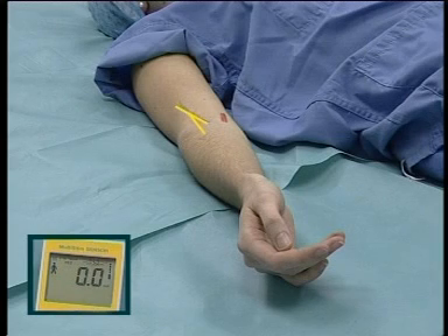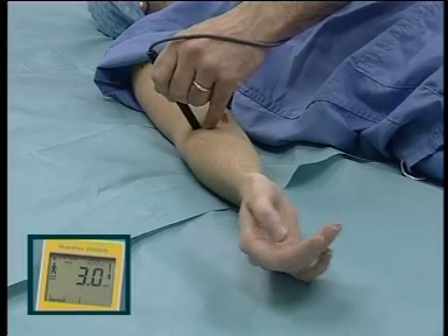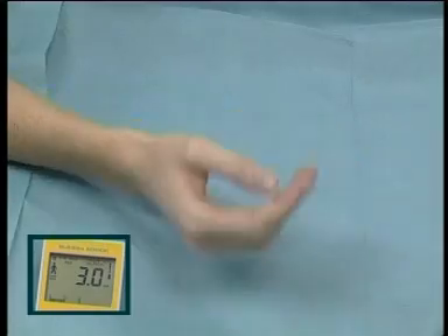Radial nerve. At the elbow, it lies in the groove between the brachioradialis muscle and biceps tendon, proximal to the flexor crease. Paraesthesia is rare. Motor response elicits mainly wrist extension.